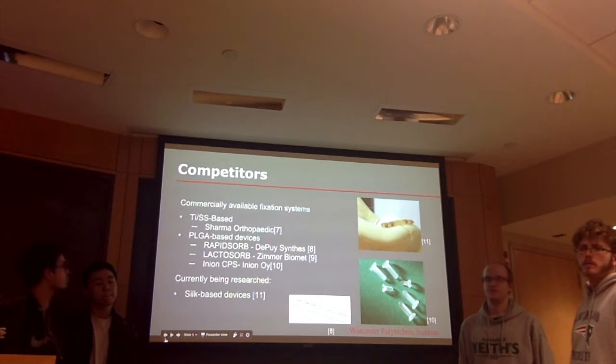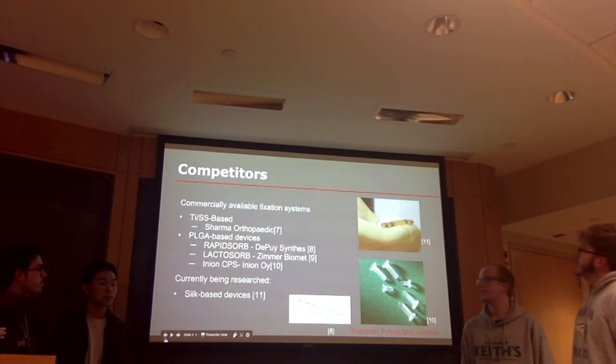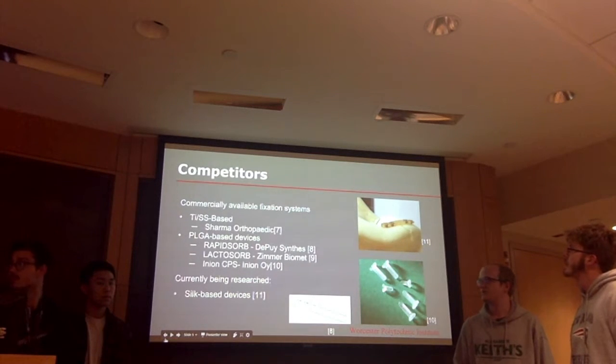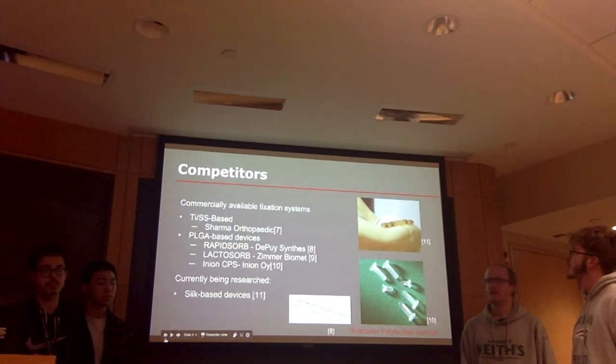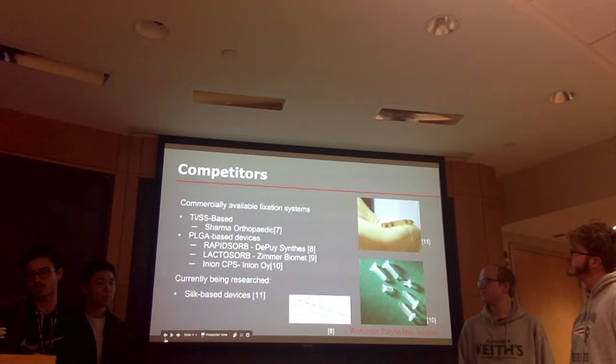Current standard for bone fixation plates are devices made of high-strength metallic alloys. Those devices have the same problems we talked about with stress shielding and retrieval surgeries. The current biodegradable-based devices are PLGA-based devices. They avoid problems with retrieval surgeries, but they're very weak. They're weaker than native bone and the magnesium alloys that we're proposing, and they aren't suitable for load-bearing applications.